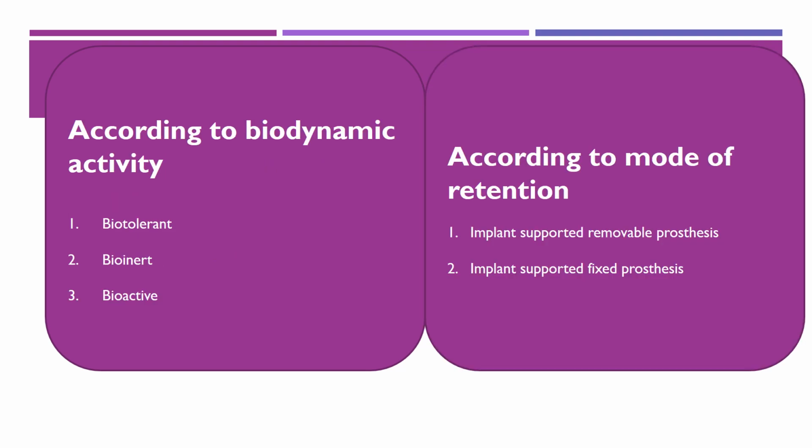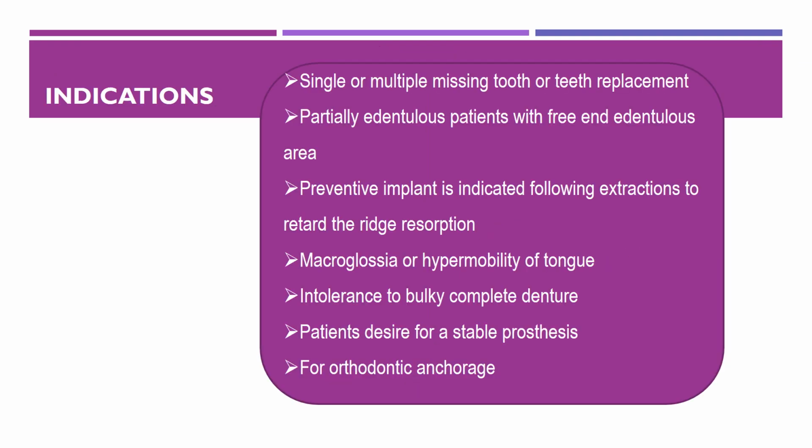According to the biodynamic activity, we have biotolerant, bioinert, and bioactive types. According to the mode of retention, we have implant supported removable prostheses and implant supported fixed prostheses.